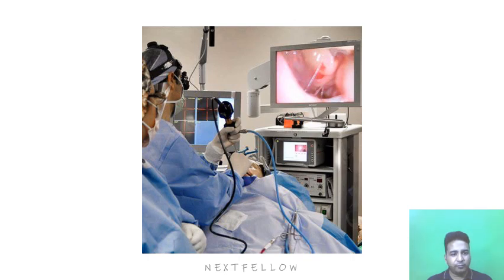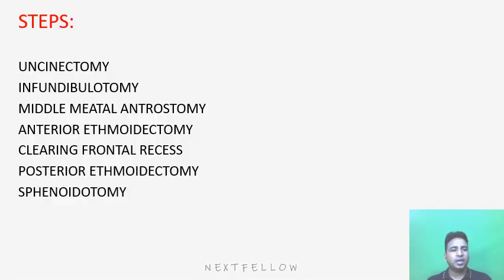That's how we perform. We introduce the endoscope with the camera mounted over here and a light source here. And we can see the images on the TV, and we are just operating by means of instruments. What are the steps? Now the first step will be uncinectomy. What we will do? In the middle meatus, suppose this is my middle meatus, there lies a 3D structure which is the uncinate process. So firstly we have to remove the uncinate process.